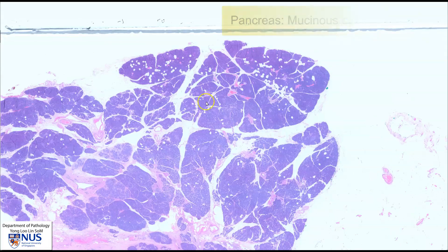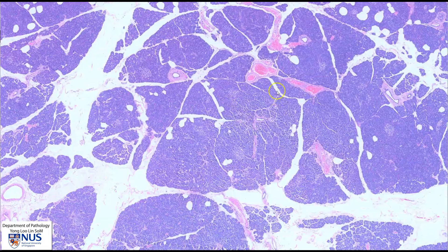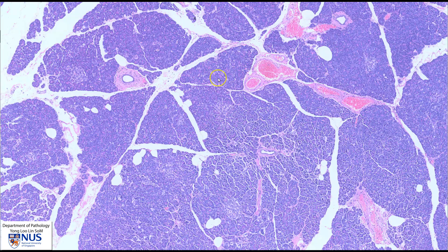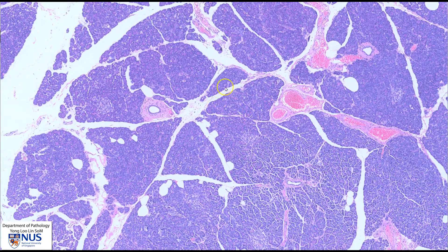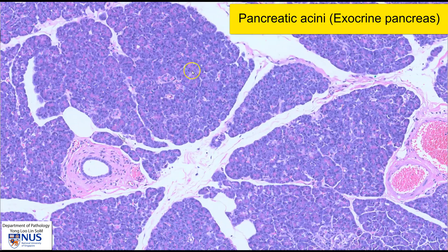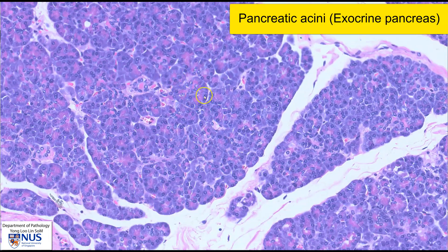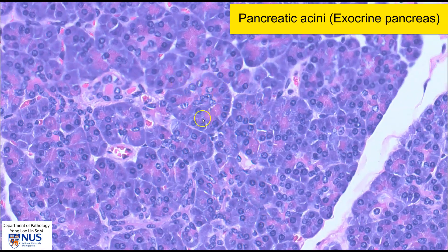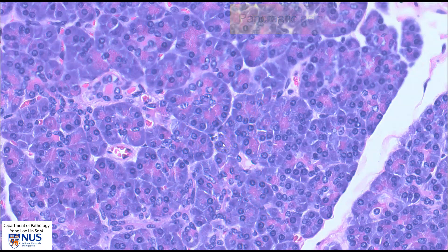Let's have a quick recap of normal pancreatic histology. We can see that the pancreas is composed of these lobules of acinar cells, and these acinar cells form grape-like rounded structures, or acini, and these cells produce our digestive enzymes. They are the exocrine component of the pancreas.